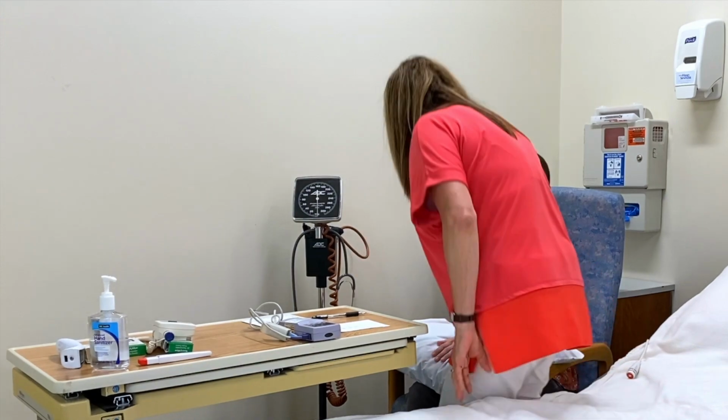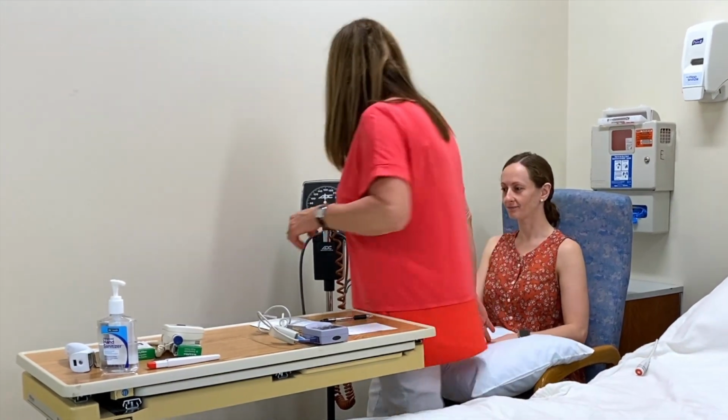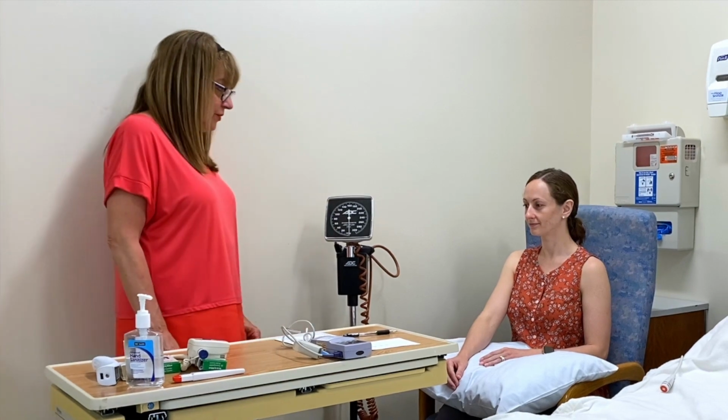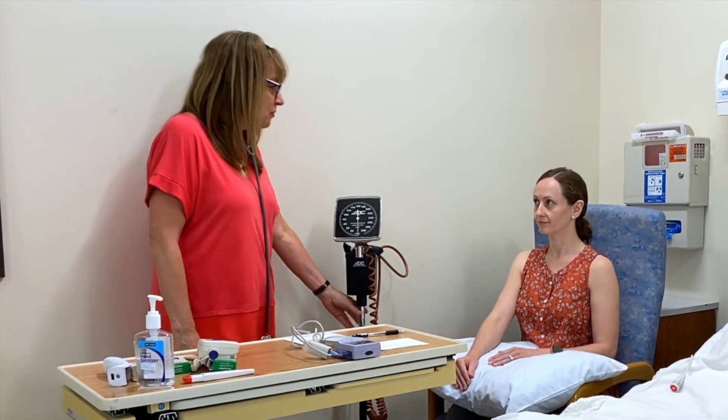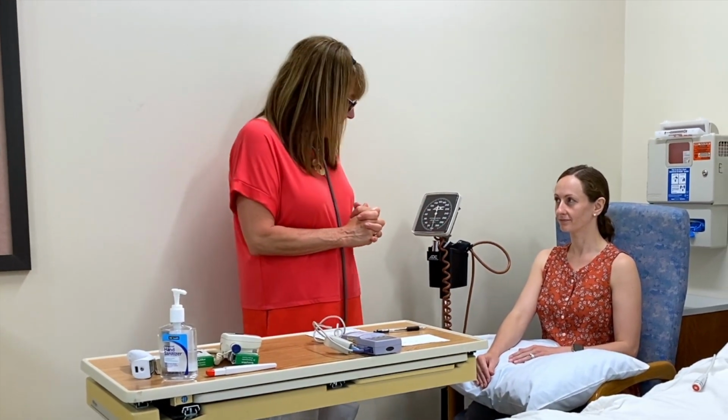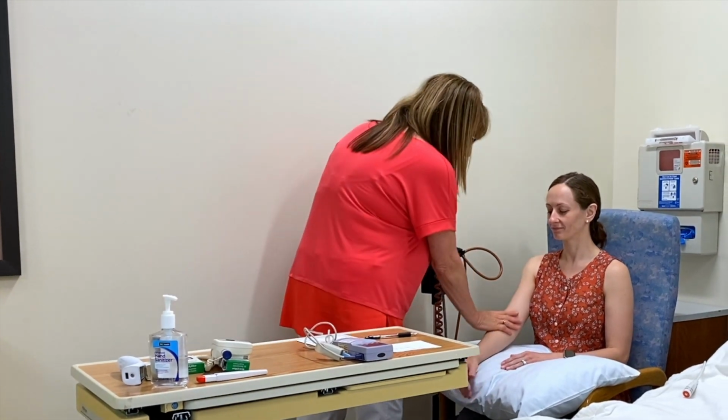So typically we take it on the left arm, but I'm going to take it on the right arm. Now there's been some discussion about not crossing your legs when you're taking a blood pressure reading, because that apparently increases venous return. But the vascular studies indicate that that does not affect the blood pressure for a person that's sitting and has good vascular flow, but that's what you'll see in the textbooks. How's that? So the first thing I'm going to do is palpate her blood pressure.